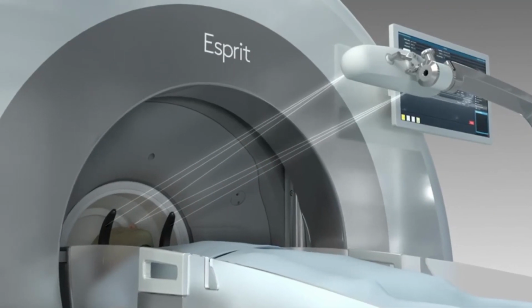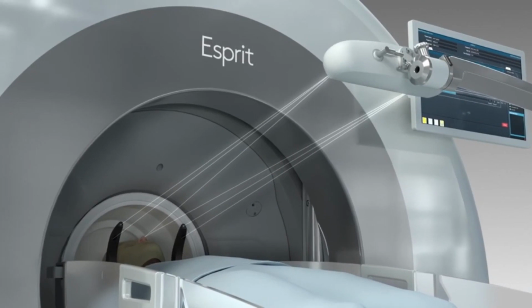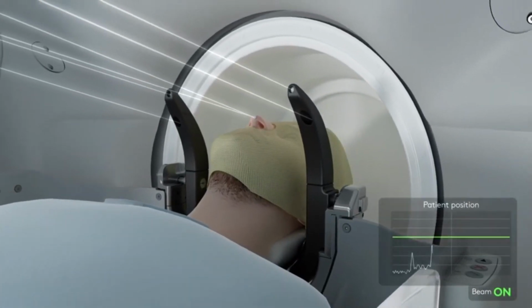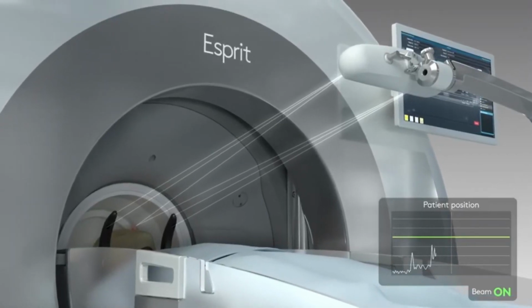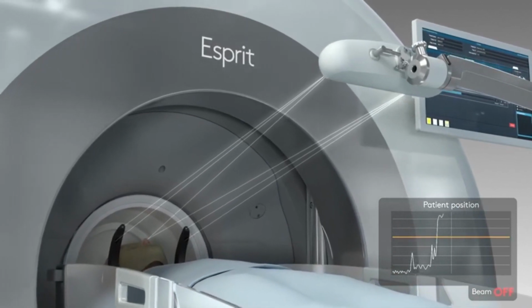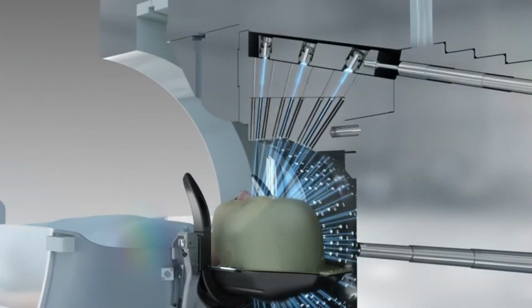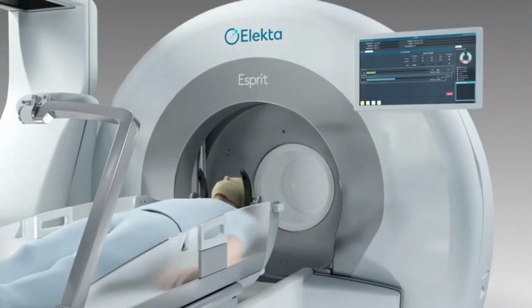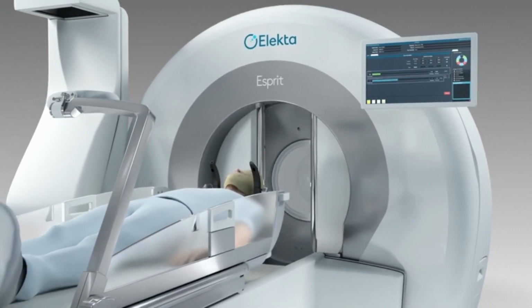The infrared high-definition motion management system tracks the patient movement using markers on the patient's nose to monitor movement of the patient during treatment in real time. Should the patient inadvertently move during the treatment delivery, the system ensures that the treatment is automatically paused. Once the treatment is completed, the collimator returns to the closed position. The patient is automatically moved from the treatment position, and the shielding doors are closed.